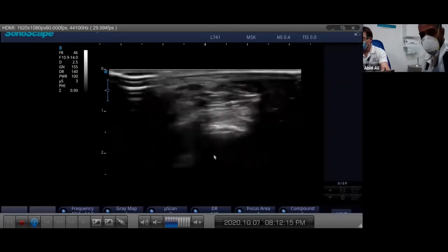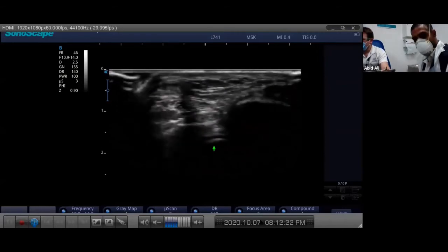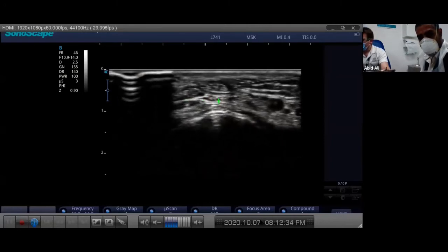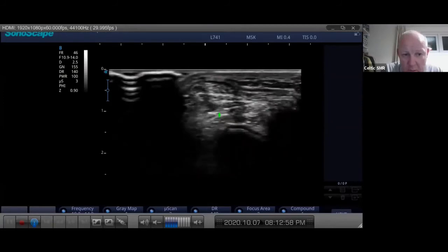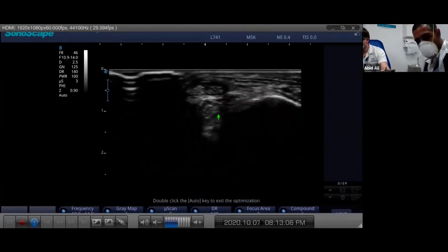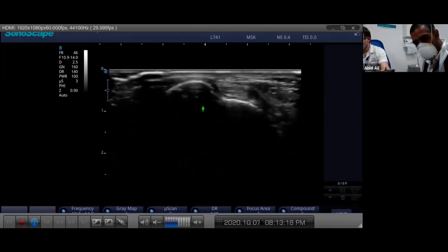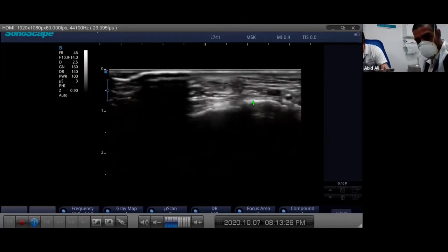Let's go medially here and try to pick up our tibialis anterior. I'm just going to ask Adrian to relax his ankle - we're going to pick up the tib ant here and pinpoint it. Let's try and get that right in the middle of the screen. You should see a little bit of a black halo around the tendon - that's quite normal, it's not a sign of teno-synovitis. The tib ant crosses here going anterior-lateral to medial.